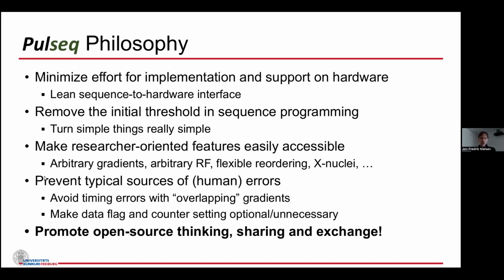An important part that I really appreciated in the MATLAB PulseSeq toolbox is that it has error checks, so it's very easy to make simple mistakes regarding the timing when you put things together, and the toolbox catches a lot of those. And overall, to promote open source thinking, sharing, and exchange.